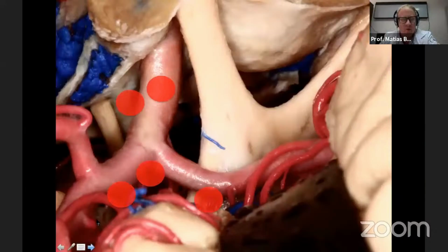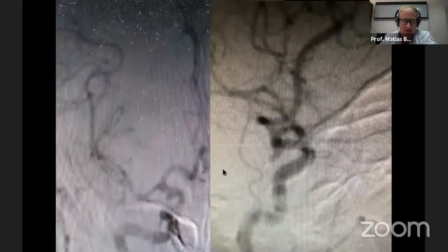And we can approach some special kinds of aneurysms using the trans-eyebrow approach, especially for dorsal ophthalmic aneurysms, for posterior communicating aneurysms facing the lateral border of the carotid artery, and M1 or A1 or carotid bifurcation aneurysms. These locations are special for planning this kind of keyhole surgery.